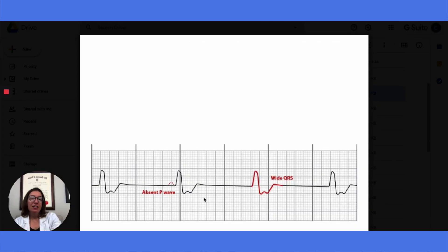Here we have an idioventricular rhythm. You can see we don't have any P waves here, and we have a really wide QRS, which is how we know that we are dealing with a ventricular rhythm. We can't assess the regularity of the atrial rhythm because we don't have P waves. But we can assess the regularity of the ventricular rhythm and it is regular.